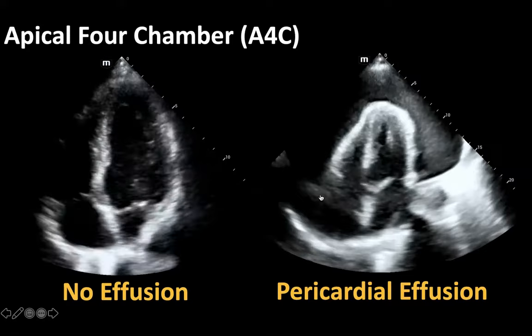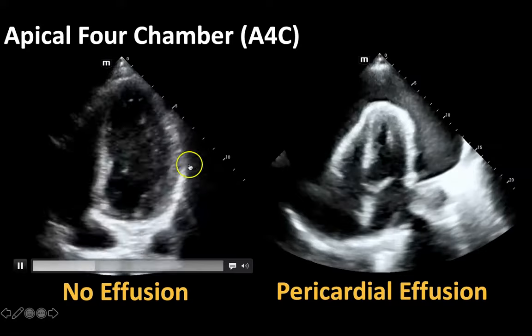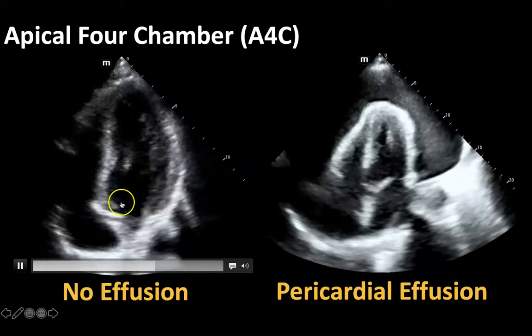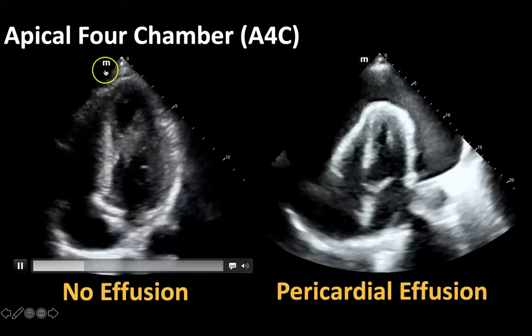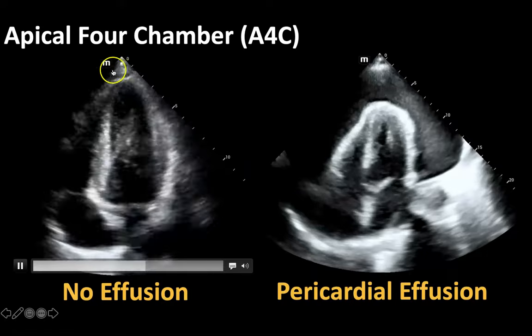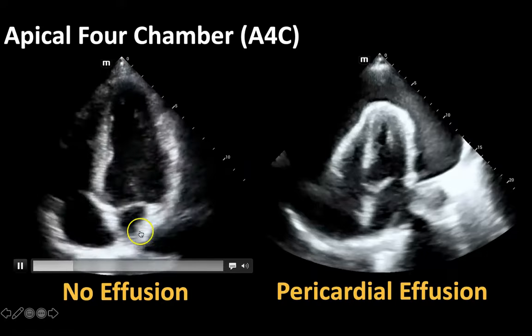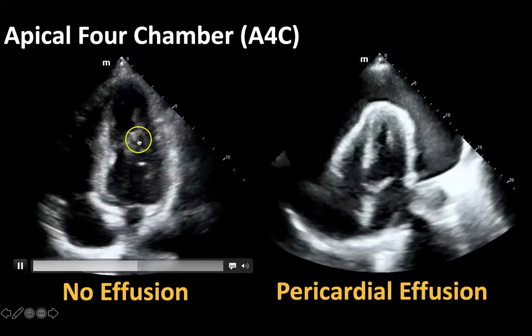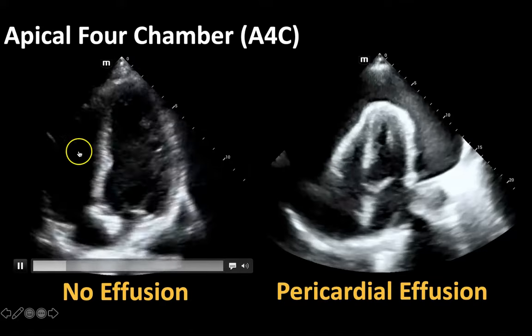We can also assess for effusions in your apical four chamber view. Here's your four chambers with our probe going in at the apex of the heart — here's your left atrium, your left ventricle, your right atrium, and your right ventricle.